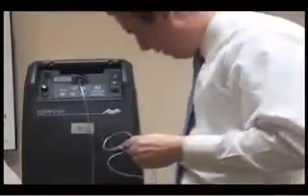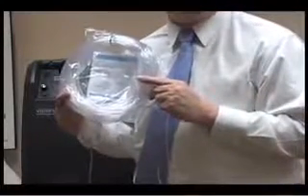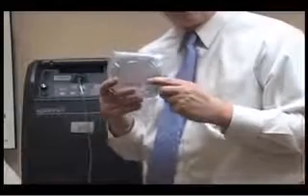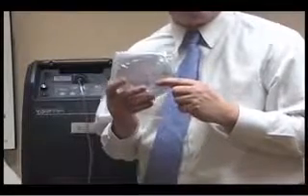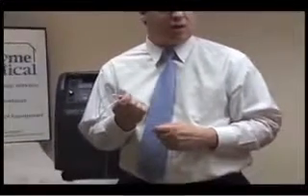You will also receive different lengths of tubing for extra mobility. You will receive 50 feet of oxygen tubing and 21 feet of oxygen tubing as well. Please remember to appropriately attach the oxygen tubing with the little oxygen connectors that you will receive. I will now have Kim demonstrate to you the proper cleaning techniques as well as troubleshooting tips.